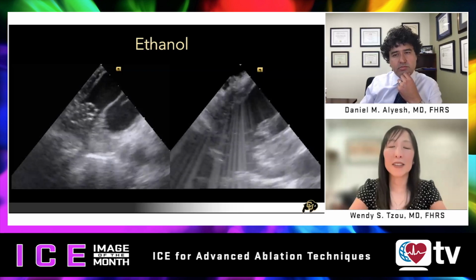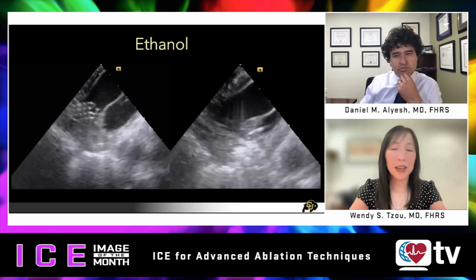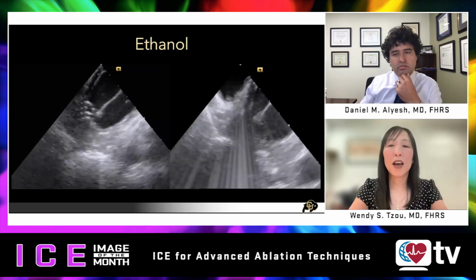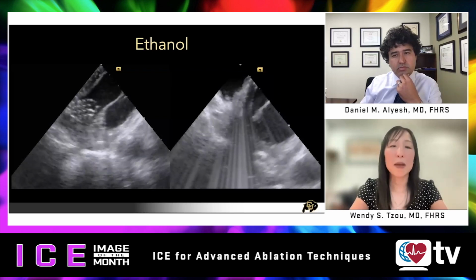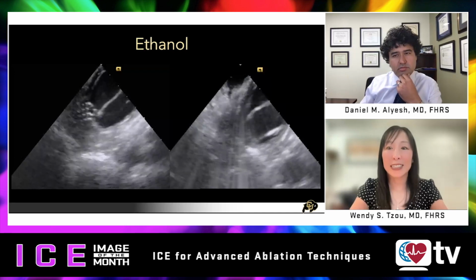If you see staining, that's a sign that you've damaged the intravascular network there, and it's all caught up in the tissue. I wanted to see if we could also see it on ICE, which in this one case, and we've subsequently seen it on many others. So I'd like to watch it as we're infusing, just to get an idea.